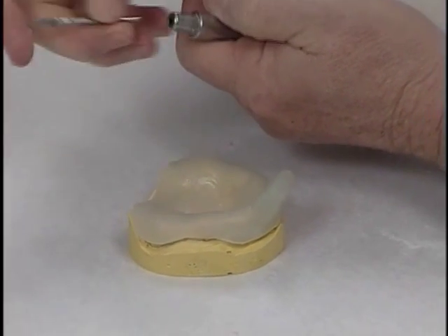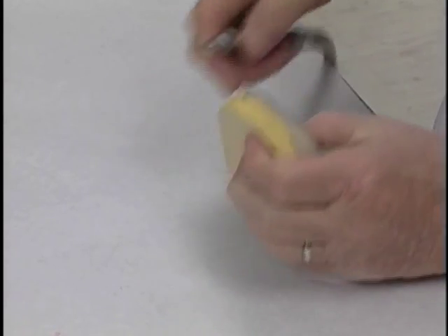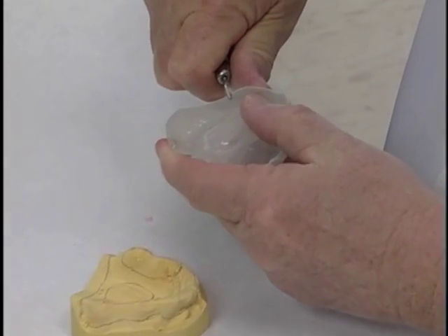So we'll put a much smaller burr in, and now we're going to judge where that buccal frenum would be and make a notch for it.